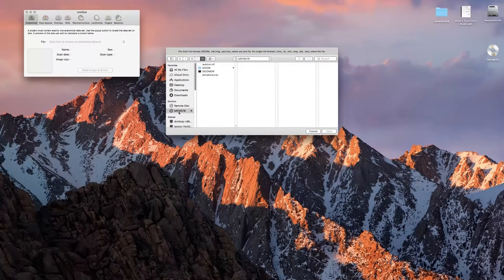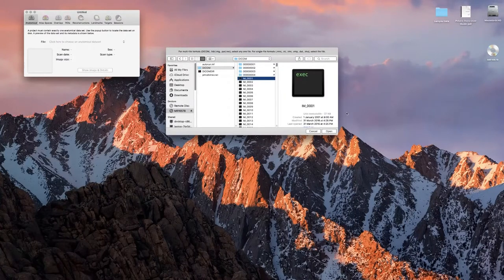There we are. So it's in DICOM. DICOM's a good format. It's the most common MRI format that we see. So if we open that, BrainSight is going to scan all of those files there, and it should upload them all. And we should find, we'll wait for that. I think it's not there.